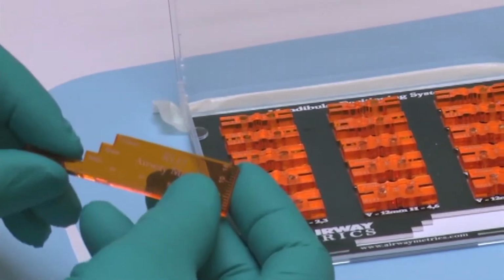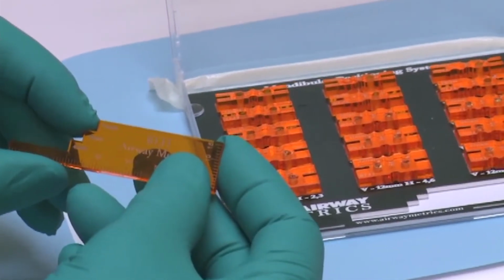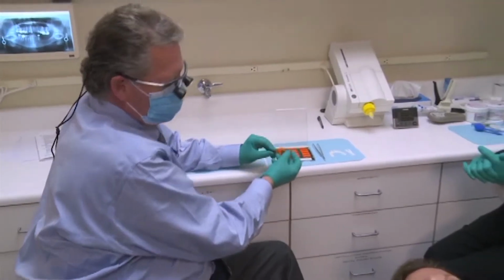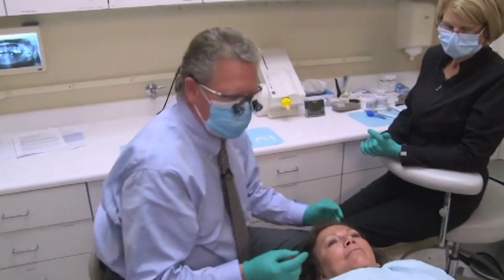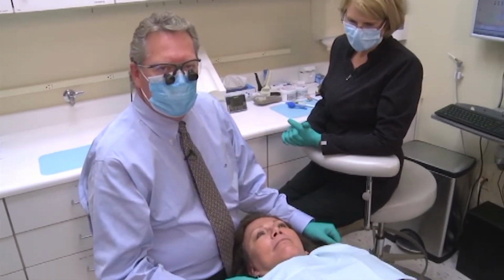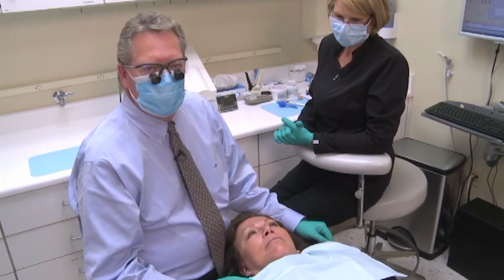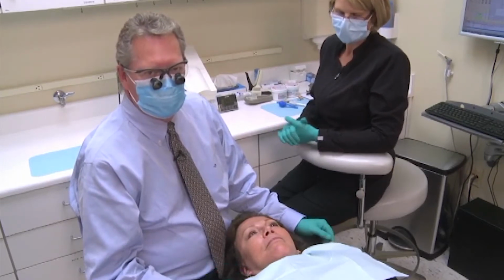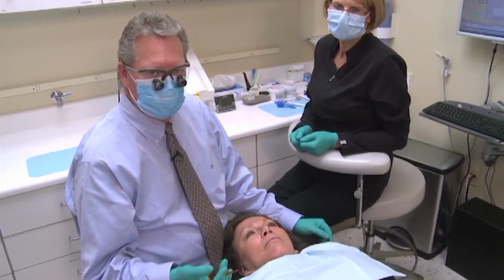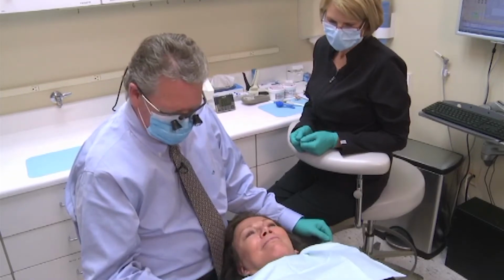And this is 4 millimeters, the next step is 8 millimeters, and the next step is 12 millimeters of vertical height. So this is where the fun begins, and we do have a lot of fun doing this. We're going to ask Kim to give us her best snore. And we obviously know that she snores because that was part of her intake information that we did with her when we reviewed her health history. So Kim, let's hear it. Give us your best snore.